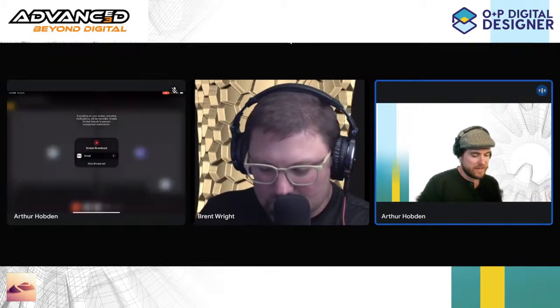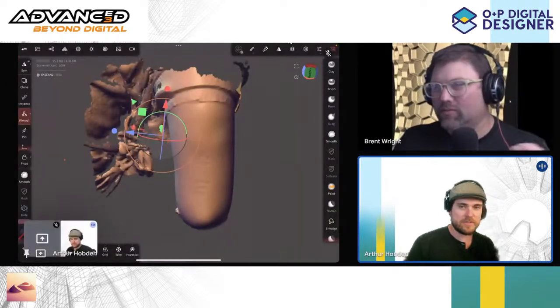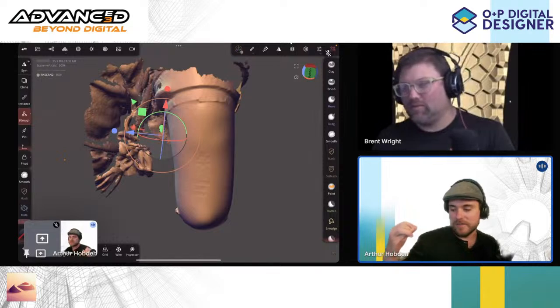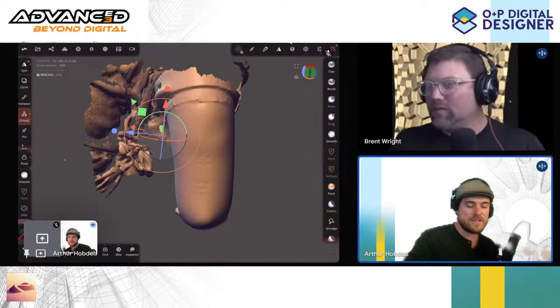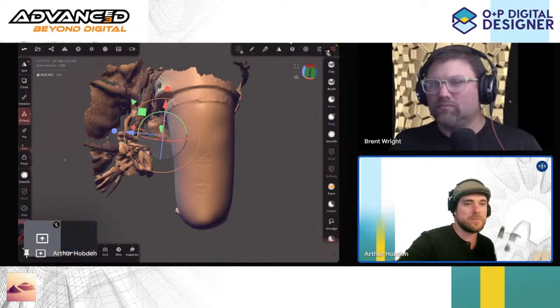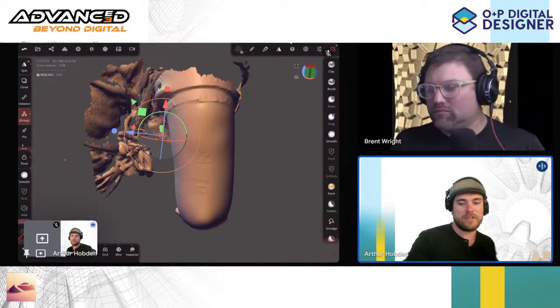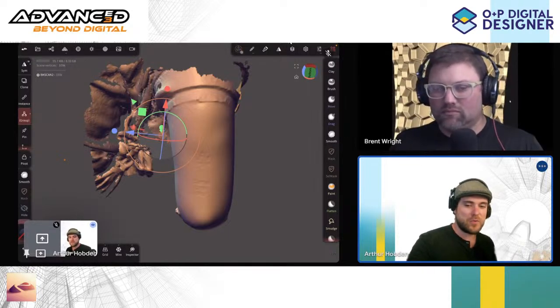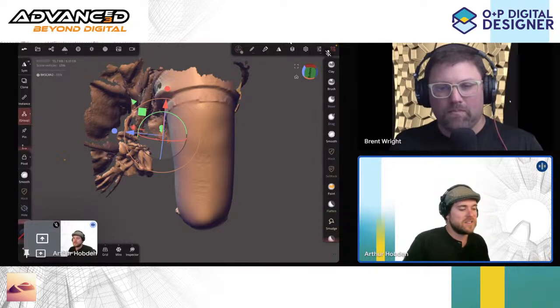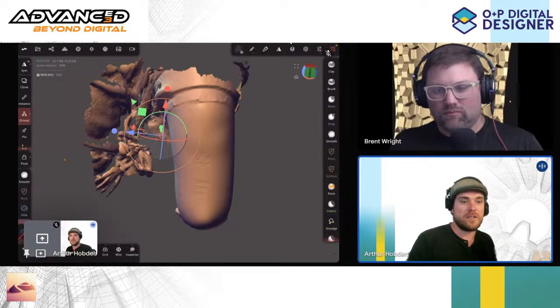But yeah, I'm glad we had a chance to just sit down and have a chat and talk about what we're working on. I was thinking it'd be cool to just sit back and flow through Nomad Sculpt for the first time and see it through start to finish, and then we can pick up on your side and some of the cool stuff you're doing. I've really enjoyed the idea of your socket generator. So for anyone who doesn't know, when is this coming out, what does it do, and how is it serving the O&P community and advanced 3D?